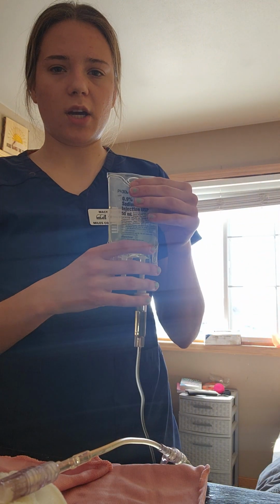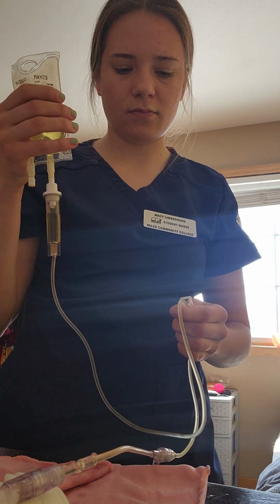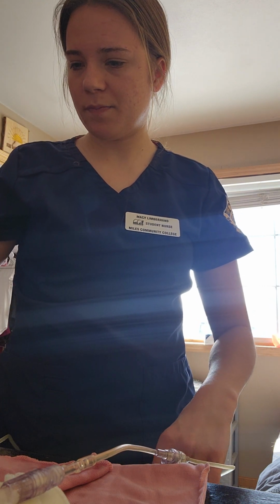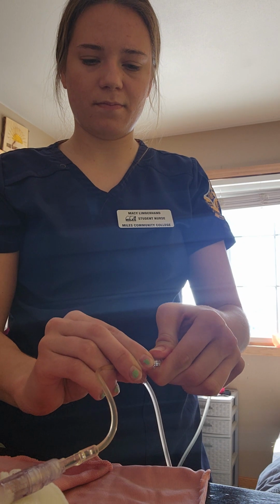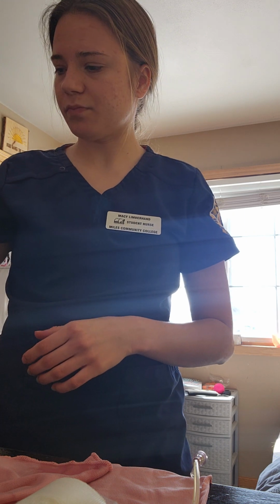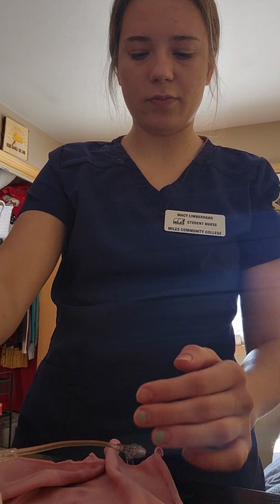Okay, so once my antibiotics are done, we're going to pretend like this is gone. I am going to clamp off my roller. And then I'm going to discontinue this from the main IV, which is just my normal saline. And then I'm going to discard of it. And I'm going to monitor how the patient did with it. So I'm going to ask her things like, look for any signs of phlebitis or anything like that. And then ask her if she had any discomfort while it was going through.